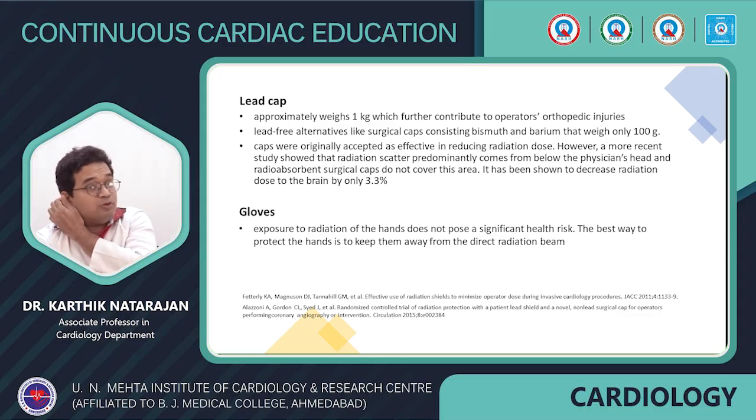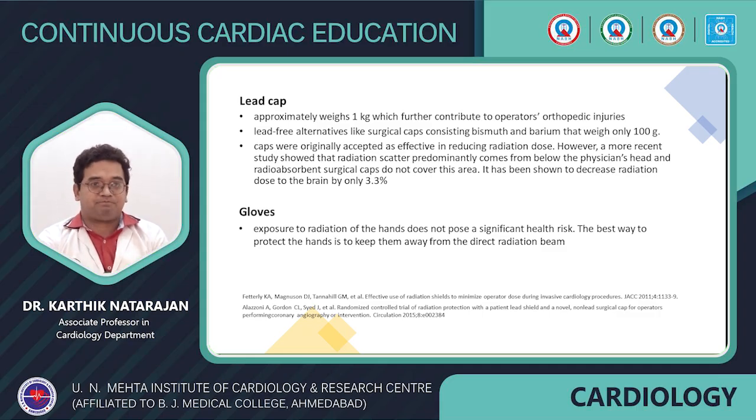Again, lead gloves have not shown to be useful, because if you wear lead gloves and try to expose your hands to the X-ray beam, what would happen is that the X-ray machine would detect it as an inability to see the object in question, and would try to increase the dose, so ultimately resulting in increased scatter radiation and increased dose to the patient. So the best way to protect the hands is to keep them away from the direct radiation beam.